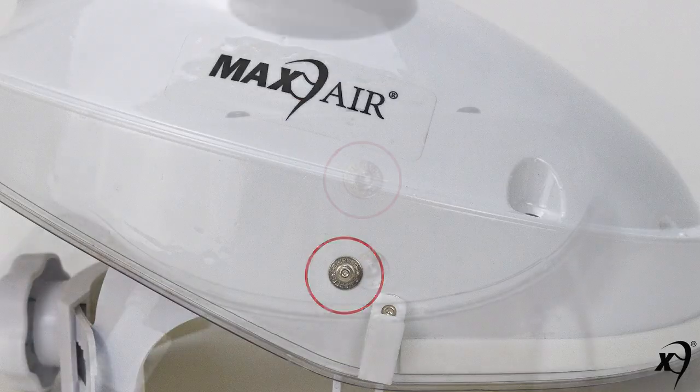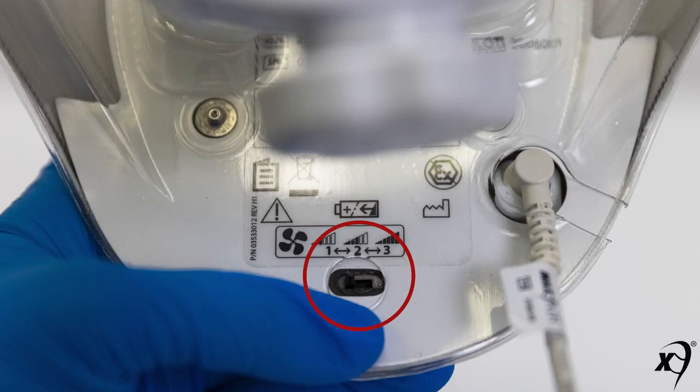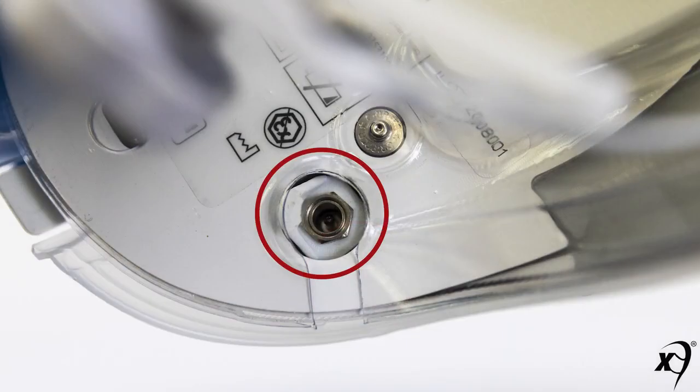Additional components include right and left side snaps, rear top snaps, a rear bottom snap, and a rear underside three-position flow control switch, as well as a rear underside power cord turn lock connector.